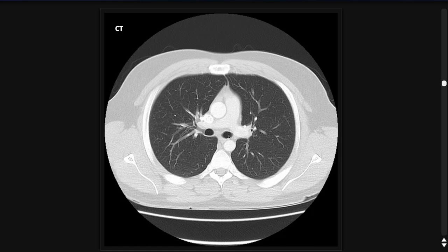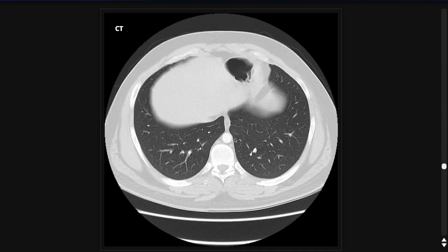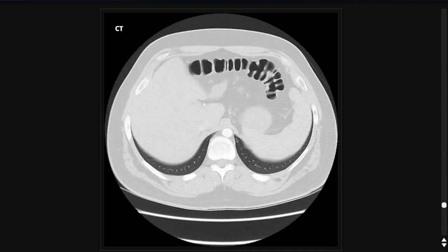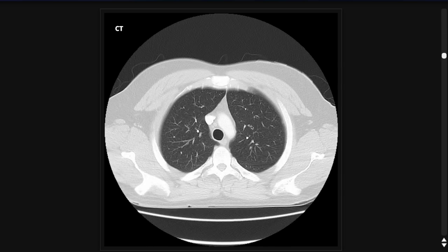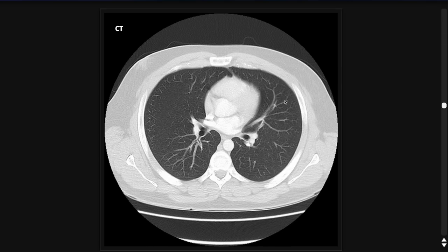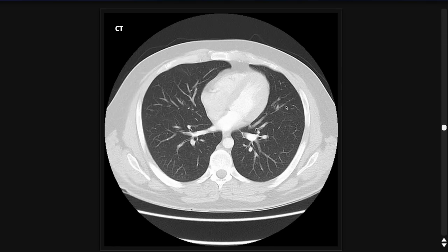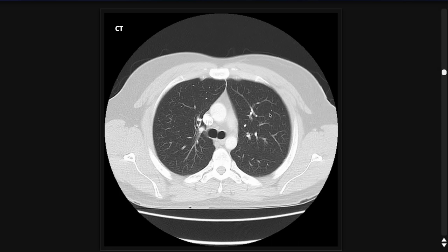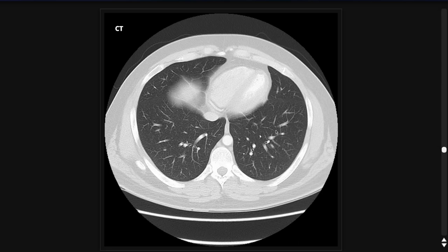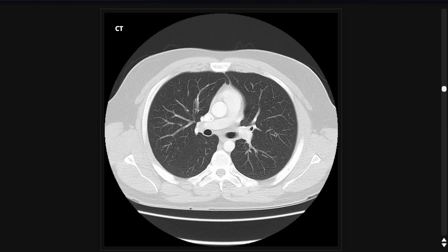After looking at the main stem bronchi, I then just look at the lungs. The things to pay attention to in the lungs — first is airspace disease. You're looking for ground glass or consolidative opacities. In this case, this is normal lung parenchyma. If you see either ground glass or consolidative opacities, there's a long differential.